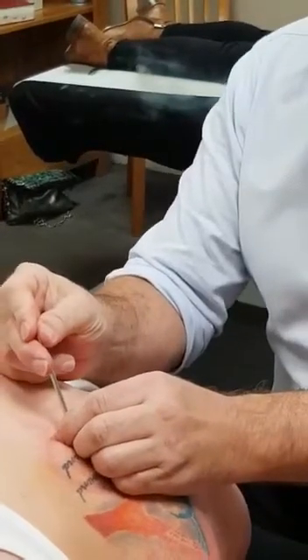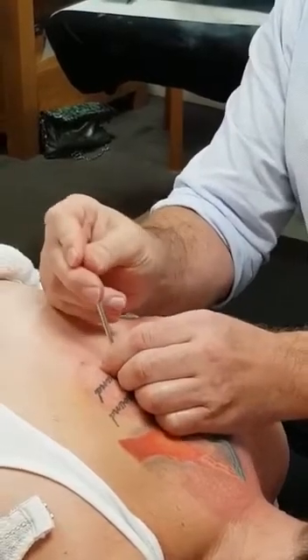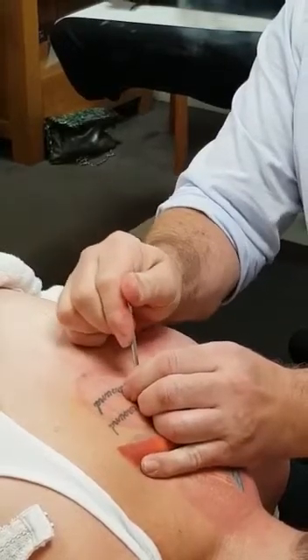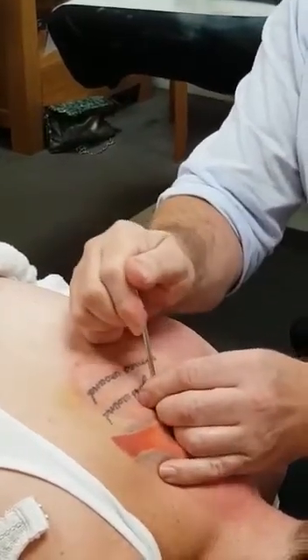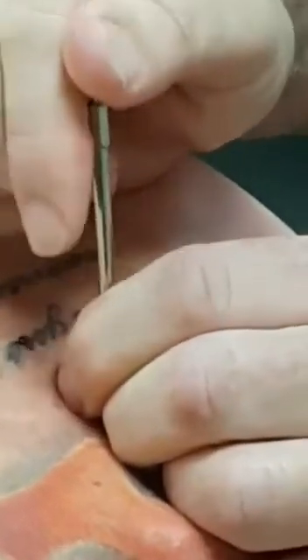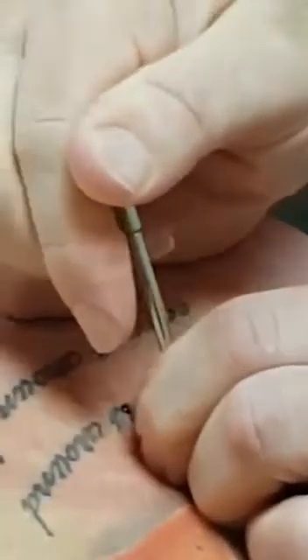Here we go. And then we follow. Depending on the patient, the needle is — you can see there — the needle is in nicely. We're looking for fibrous, shortened, contracted tissue. There's a little bit in there, so we just put tiny little small holes. It doesn't hurt. It's not painful.